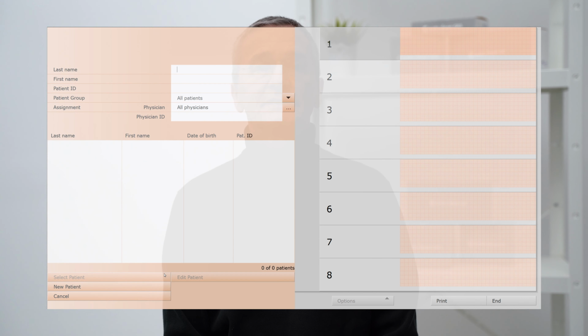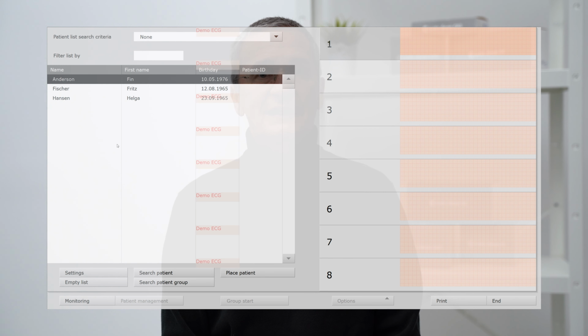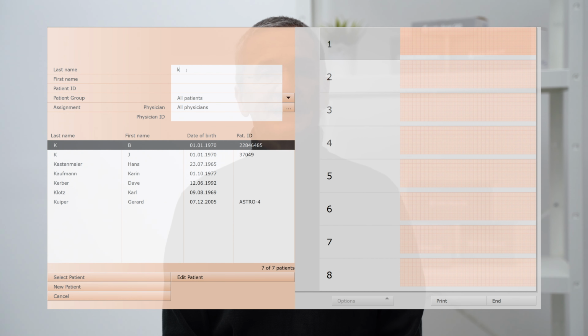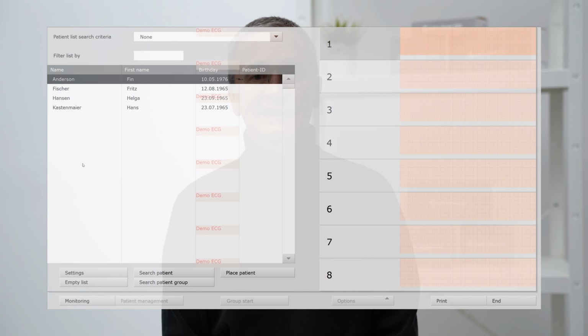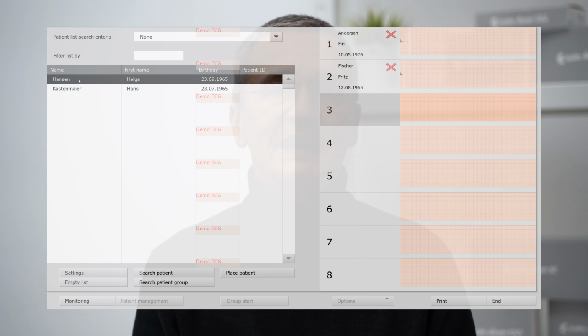By typing the button numbers, I place the patients in order. The therapist usually has enough time for this action since the patients meanwhile look for their training device and fix the guard.